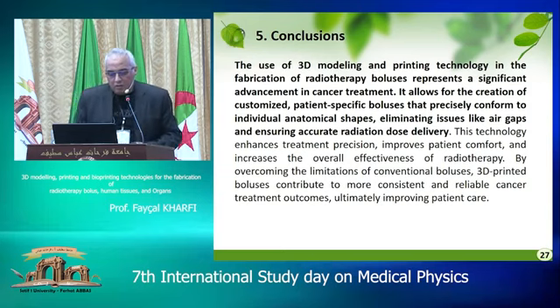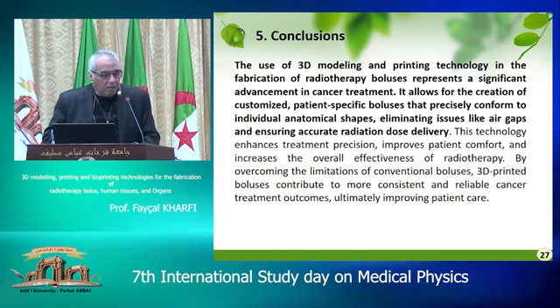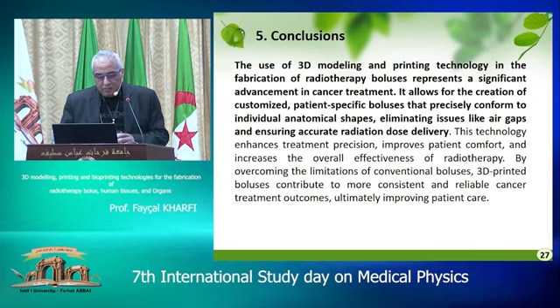As a conclusion, I just want to emphasize the importance of 3D printing in many fields, particularly in radiation therapy, for the fabrication of different kinds of devices and tools that can help in the treatment planning in order to get accurate, precise treatment planning that also ensures some comfort to the patient.